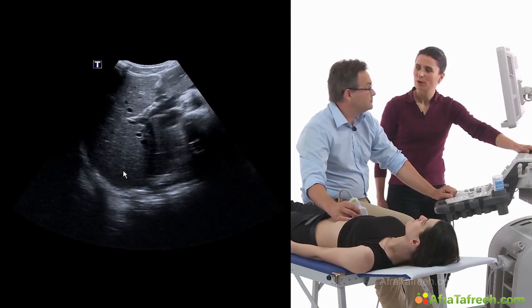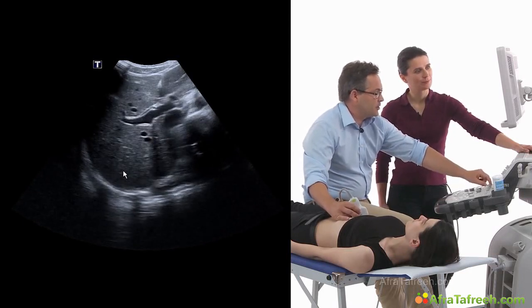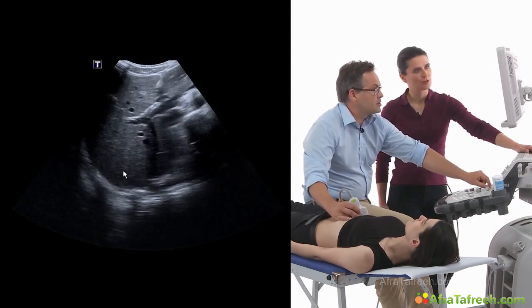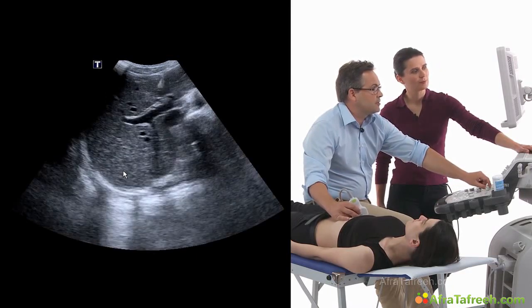So it's 4 megahertz in this case. I think so. We have to take 4 megahertz, which is a quite fair adjustment for scanning the liver.